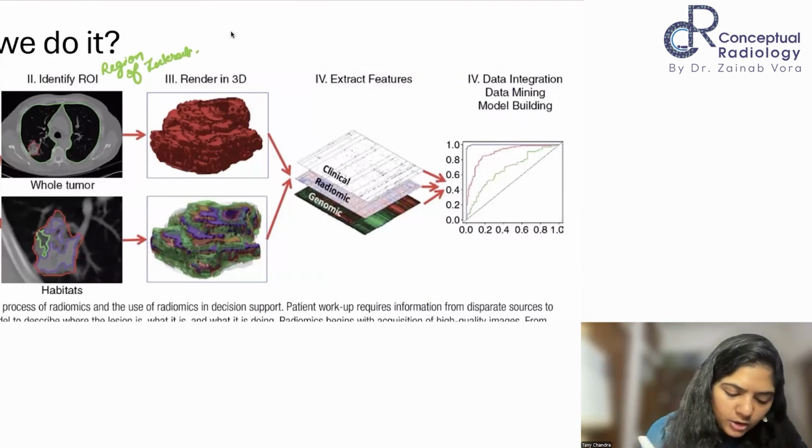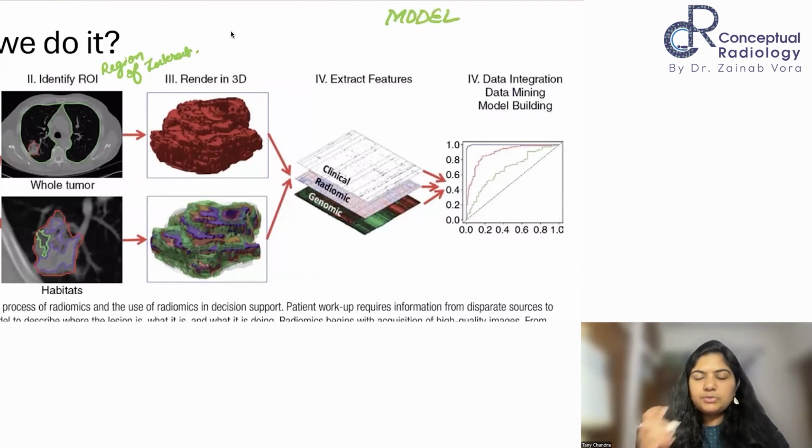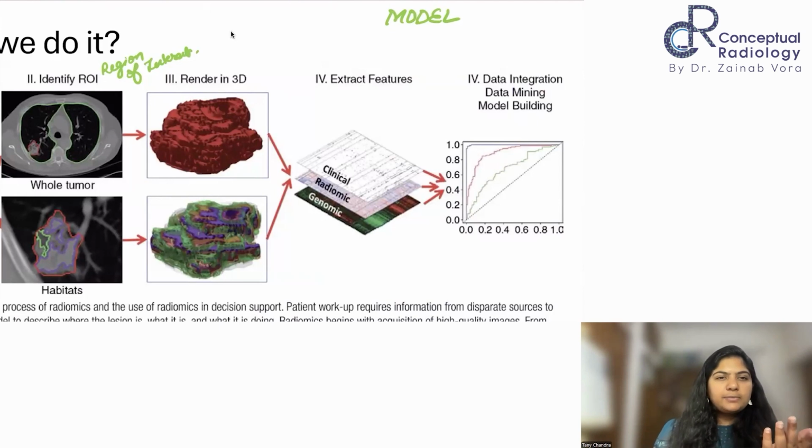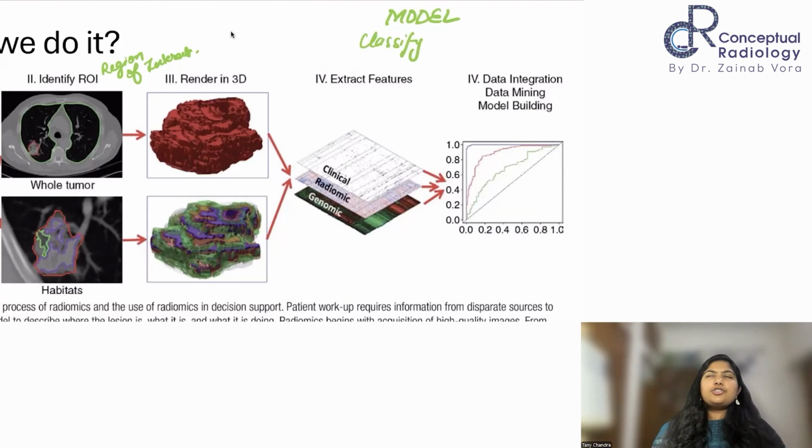So what is a model? I will introduce this word here only because we'll be using it in the subsequent slides. Nothing fancy. Think of it like a mathematical function which helps us to decide what is next, right? A lot of times you'll know, machine learning models, AI models, what do these do? Either they will try to classify, right? They can have basic functions. Suppose, basic classification task will be whether this is a diseased image or not diseased image. So you are classifying it.